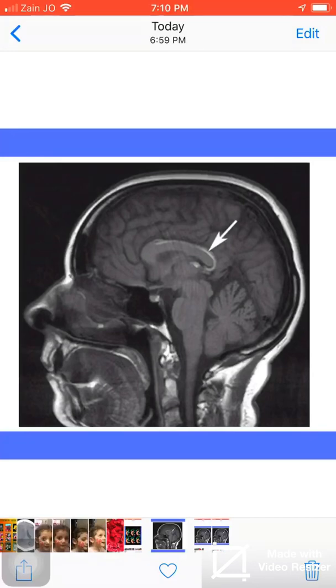As you see here in the T1 sagittal weighted image, there is a hyperintense curvilinear shadow.